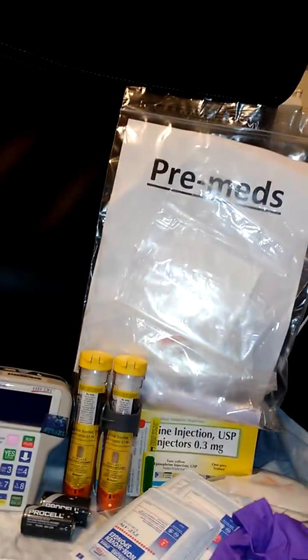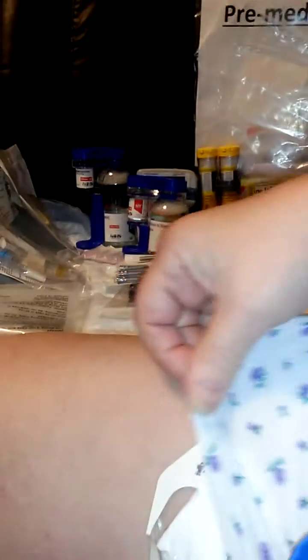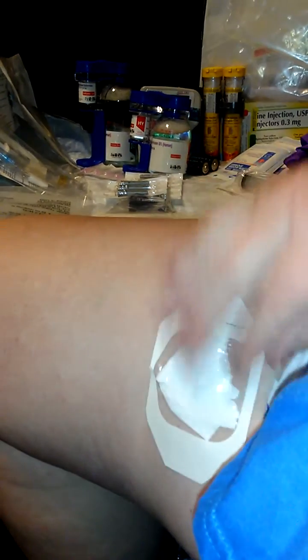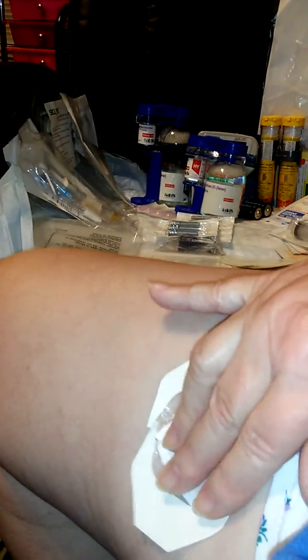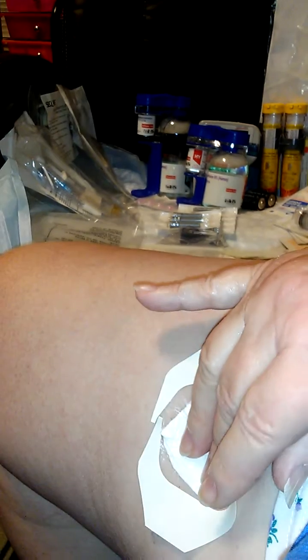I have already prepped my thighs with a numbing solution. I am wearing shorts, don't panic. This is where one of the injections, the needle site, is going to be on that thigh and over here on this thigh. And this is prepping right now. There's numbing cream underneath the gauze pad. You usually apply that about 45 minutes prior to starting your infusion, and that's been prepping probably for about 25-30 minutes now.